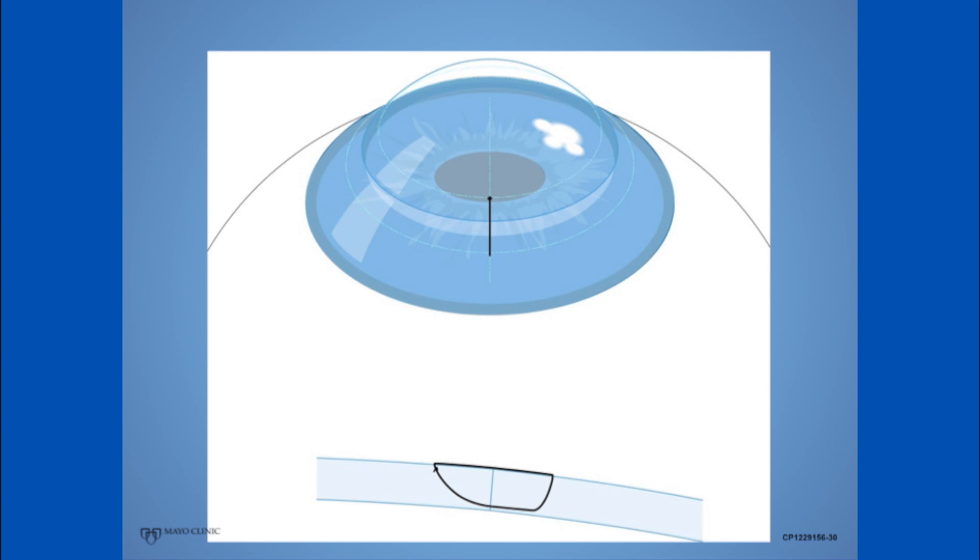First, we want the suture to be equally long on the graft and the host side of the wound, and we want that length to be consistent at each suture position around the circumference of the graft.